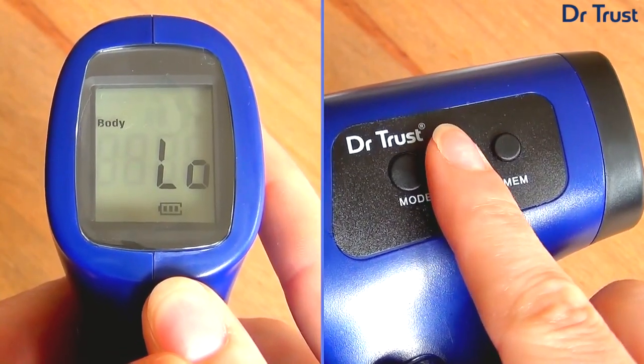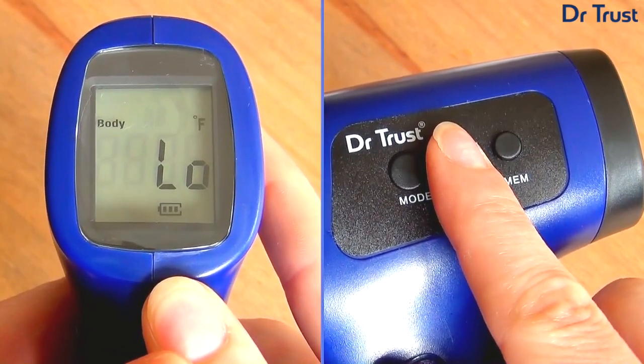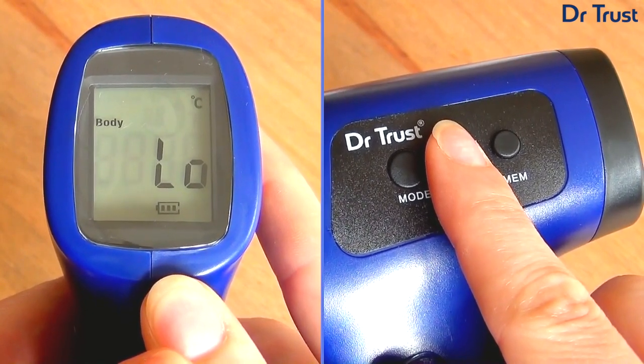You can change the unit of measurement from Fahrenheit to Celsius by pressing and holding the F or C button whilst the display is on.